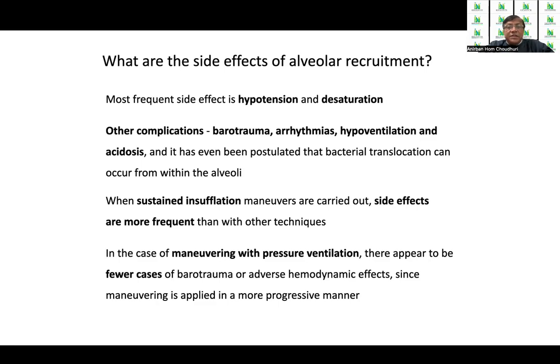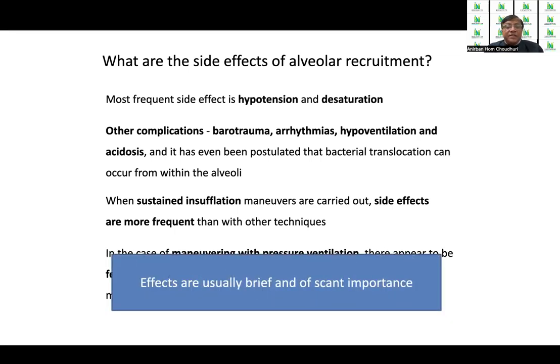So what are the side effects of alveolar recruitment? The most frequent side effects are hypotension and desaturation. The other complications include barotrauma, arrhythmias, hypoventilation, and acidosis. And it has even been postulated that bacterial translocation can occur from within the alveoli. When sustained inflation maneuvers are carried out, the side effects are more frequent than with other techniques. In the case of maneuvers with pressure ventilation, there appear to be fewer cases of barotrauma or adverse hemodynamic effects, since the maneuver is applied in a more progressive manner. We don't reach the peak so early. So the effects are usually brief and of scant importance.